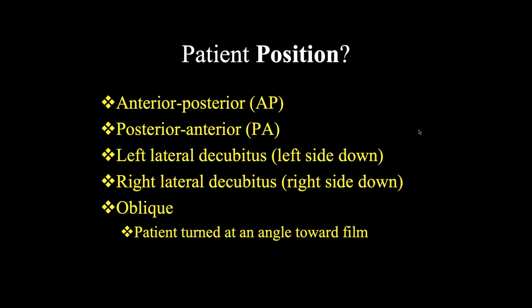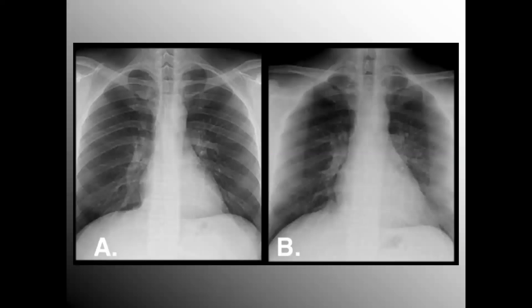And before we move on, the PA part I've talked about, the posterior anterior X-ray, we're shooting the X-ray from back to front. This would be more of your patient that goes in for a chest X-ray in a clinic in an outpatient setting, where they're asked to sort of hug the film and the X-ray beam is shot from their back to their front. Important to note is the term PA or AP X-ray describes the direction of the X-ray beam. PA, posterior anterior, means the X-ray was shot from back to front, whereas with AP chest X-rays, the X-ray is shot from front to back.